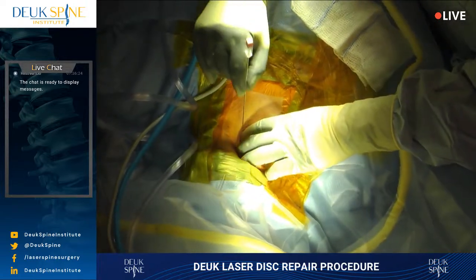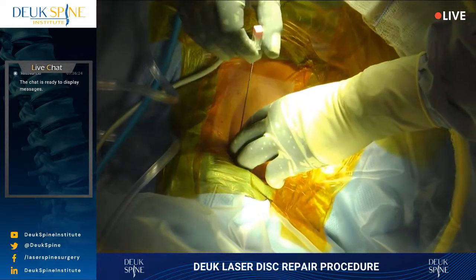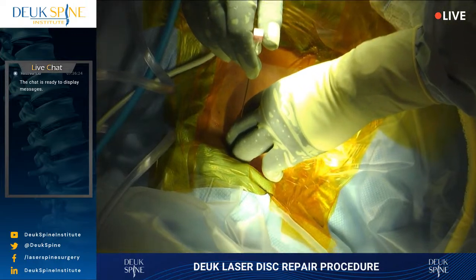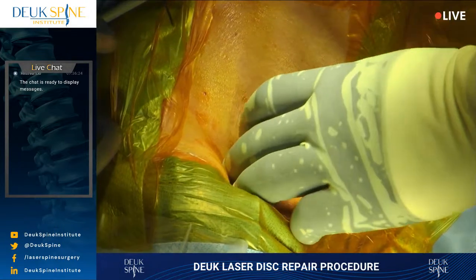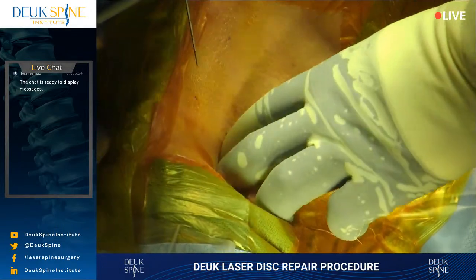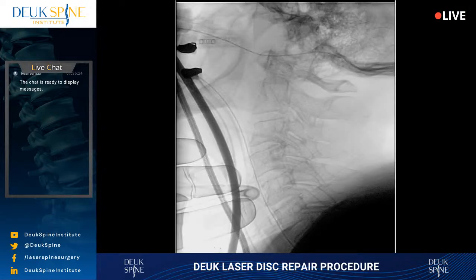All right. This is the most perfect positioning I could have asked for. So thank you guys. Great job, Luis, doctor. Shot. All right. So we're a little bit lower than we need to be. We need to be at C3-4. Now C3-4 is tough to get to because of the jaw and the salivary glands.